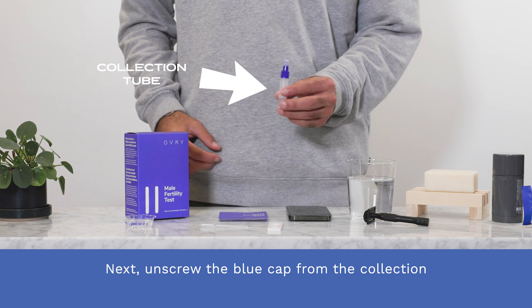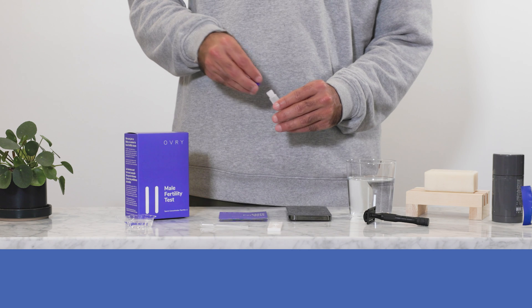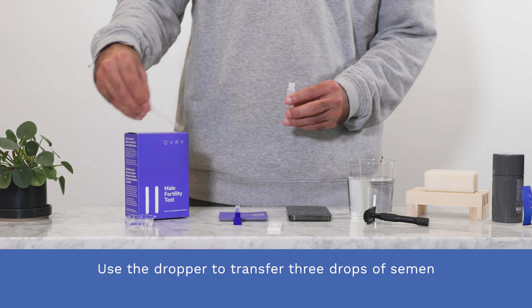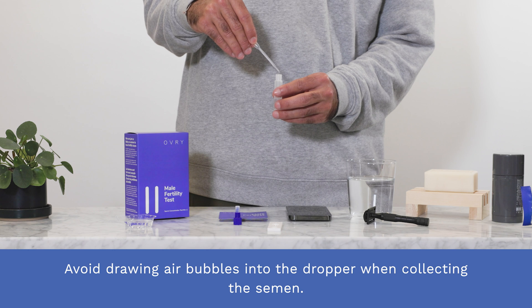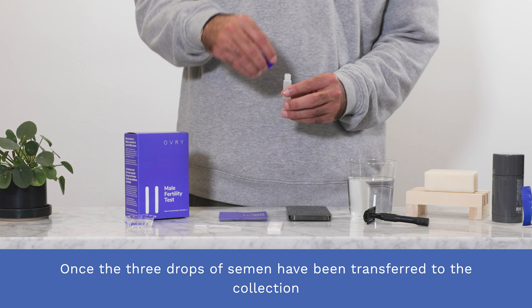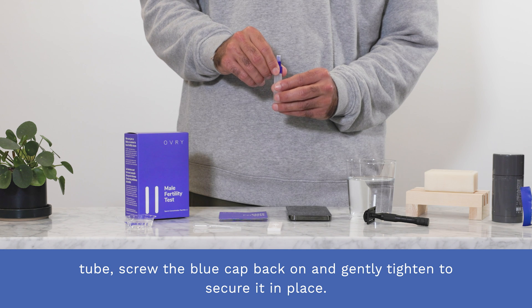Step four. Next, unscrew the blue cap from the collection tube. Use the dropper to transfer three drops of semen from the sample collection cup into the collection tube. Avoid drawing air bubbles into the dropper when collecting the semen. Once the three drops of semen have been transferred to the collection tube, screw the blue cap back on and gently tighten to secure it in place.